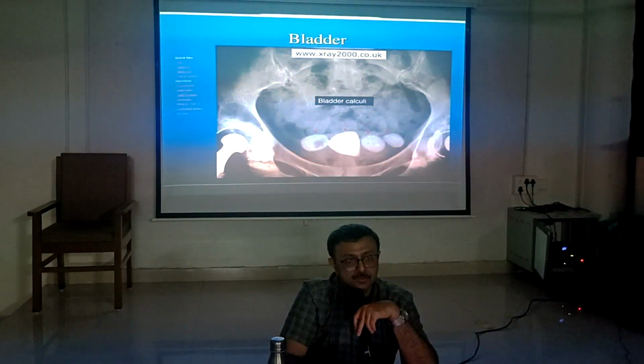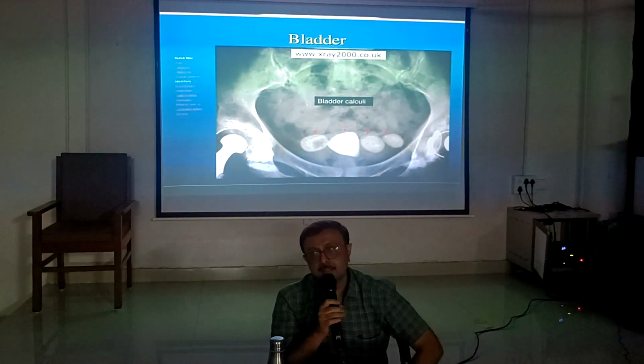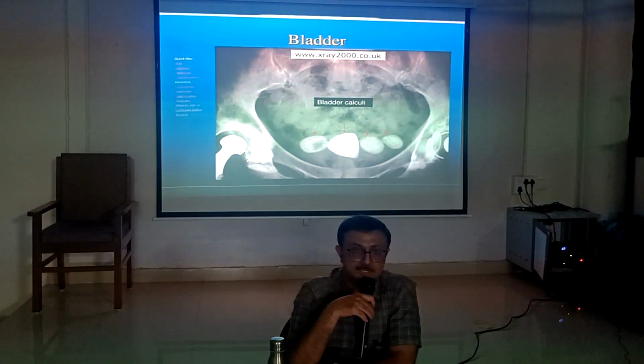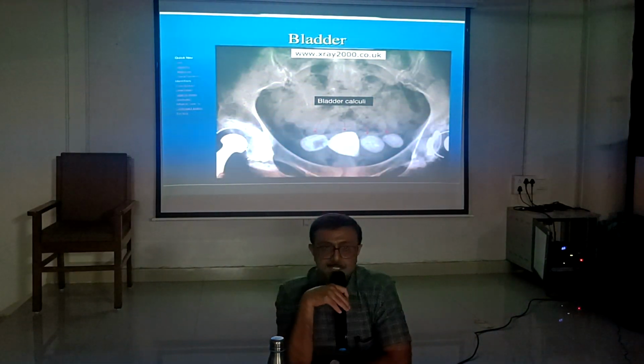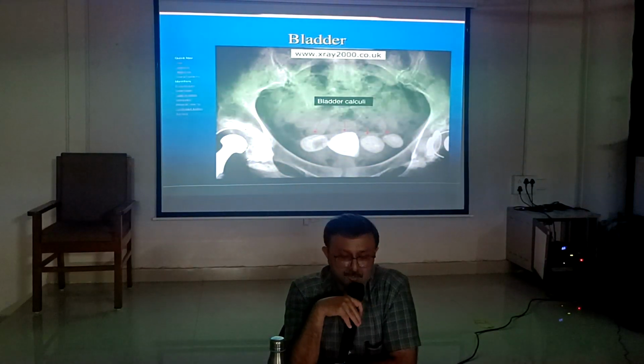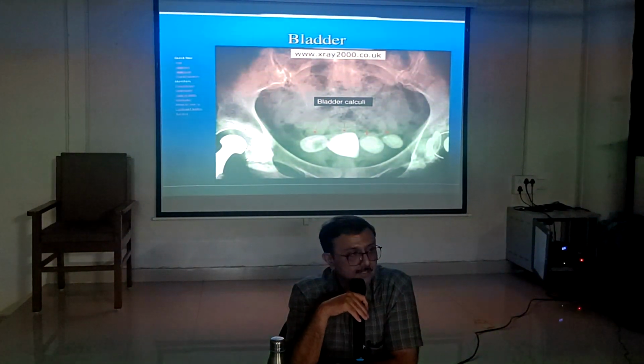Urinary bladder. Okay, so these are the radiopaque shadows in the pelvis. Sometimes in the right hemipelvis, left hemipelvis, or retropubic region.